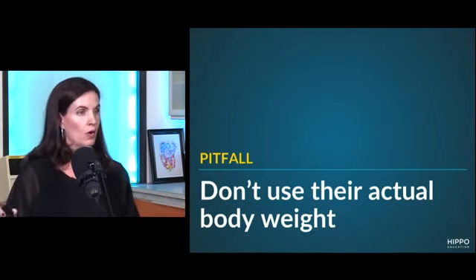Got it. The ideal body weight for my height and my gender. Correct. In fact, rather than assuming you're 70 kilos, I would say, hey sir, how tall are you? I can generally infer gender, but sometimes I can't. He's 4'2". He's on a couple blocks here. Oh, I saw the stepladder behind him. I didn't know what that was for. Right. So once I know their height and gender, I just plug that in and the calculator spits out their predicted body weight.